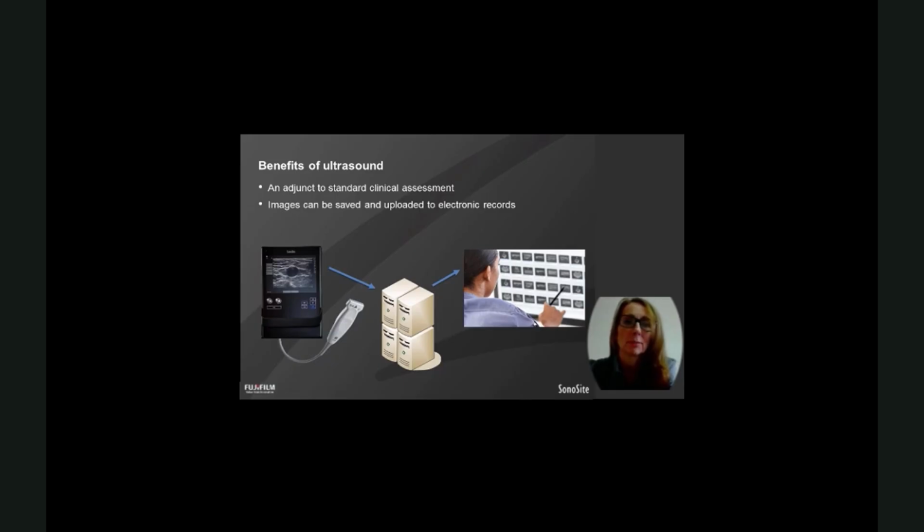We can also upload those images to electronic records, so that we can look back and do a comparison, but also send them to surgeons or nephrologists if we have any concerns.